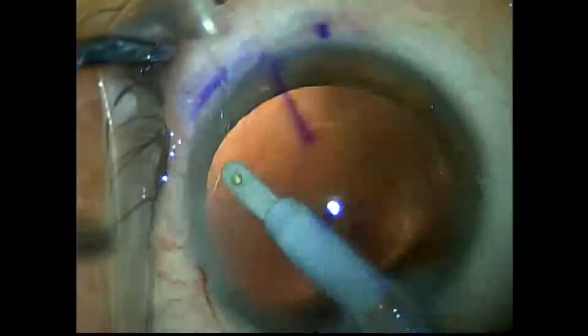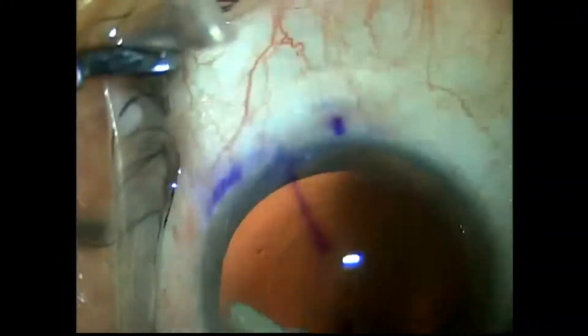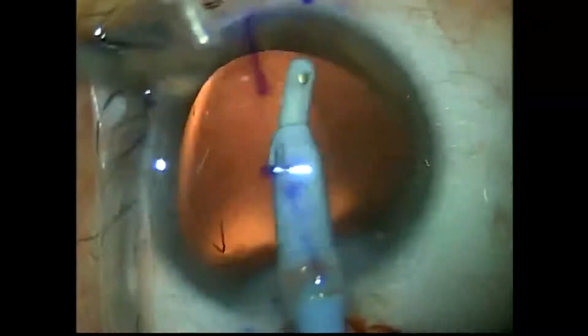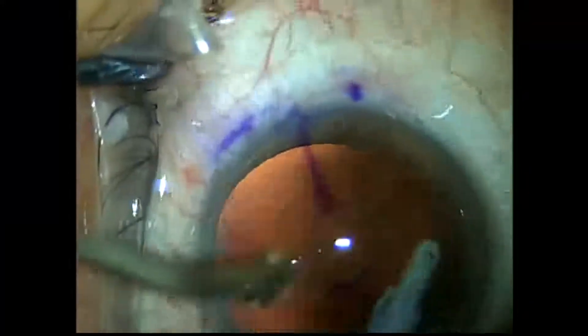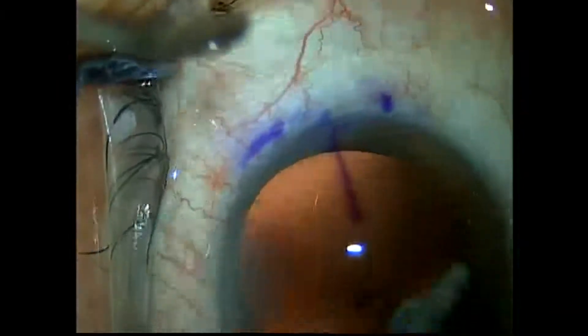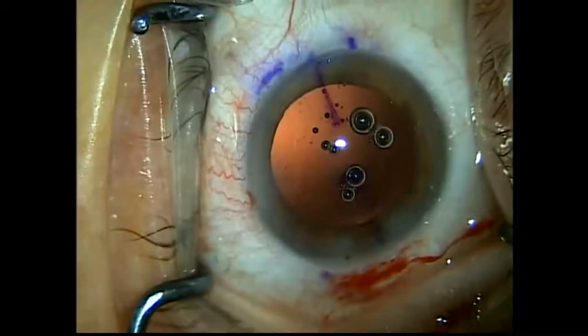I have my IA handpiece in my right hand and use my left hand with balanced salt solution attached to a bottle, just hydrating my cornea. My surgical technician is getting things ready and cleaning up so we can turn over the room more efficiently — unfortunately she's not tied up holding the bottle for me. That way two people can get two things done at one time and overall there's better flow in the operating room.